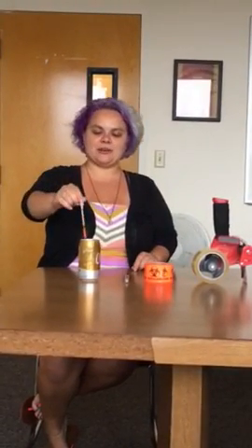My name is Stacy from The Child Project, and today I'm going to tell you what to do with a container once you put a syringe into it.